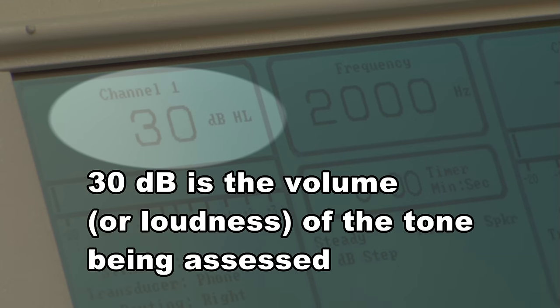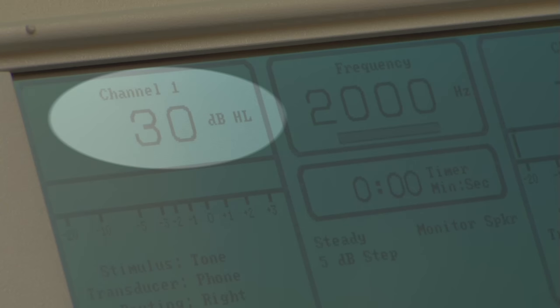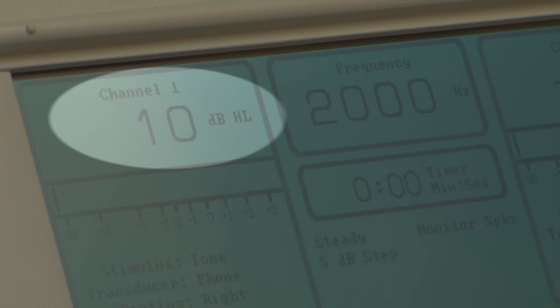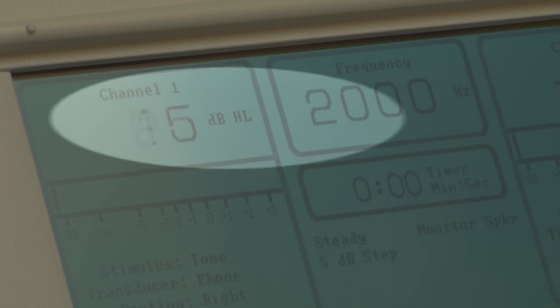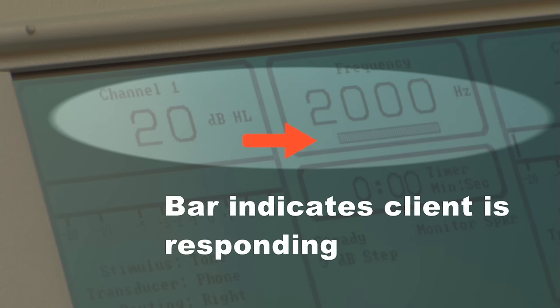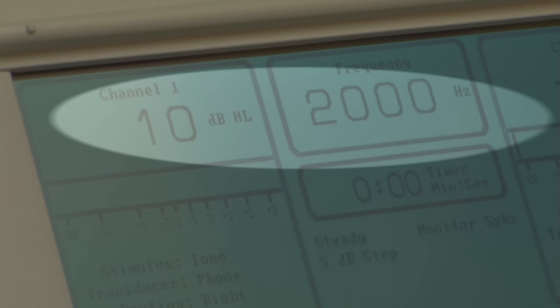The audiologist starts at an intensity level that's easily audible to the client. The level is then decreased in intensity by increments of 10 decibels, making sure the tones are not presented in a predictable rhythm or pattern until the client no longer responds. At this point, the intensity level is increased in five decibel increments until a response is obtained. This is repeated until the client has responded to two out of three ascending presentations.